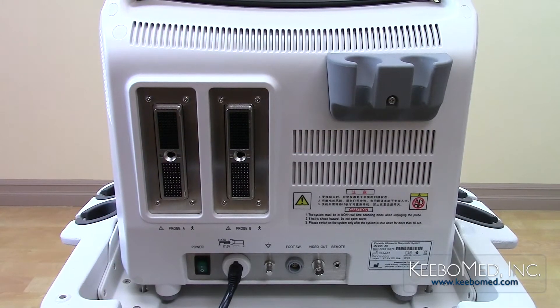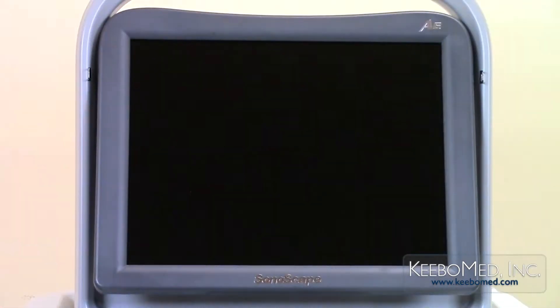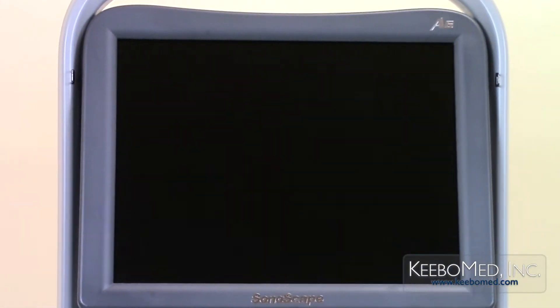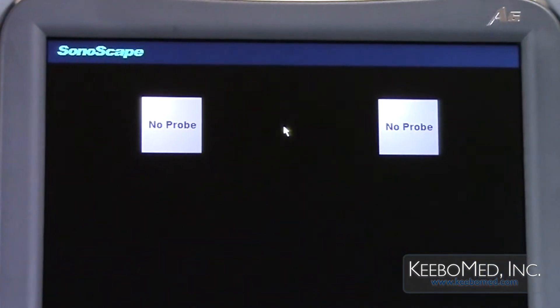Step 1. Turn on the unit and the exam screen will be displayed. The system will recognize that there are no probes connected and will display this on the screen.